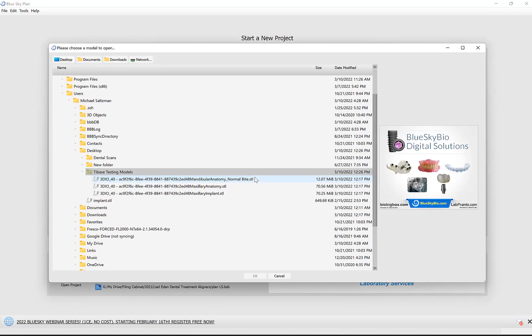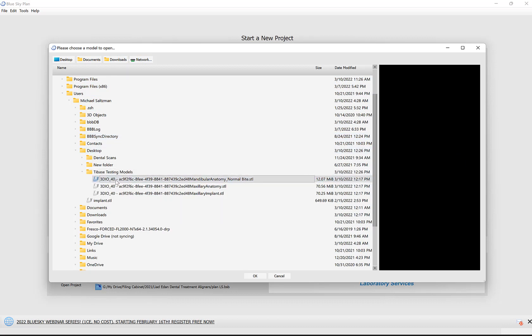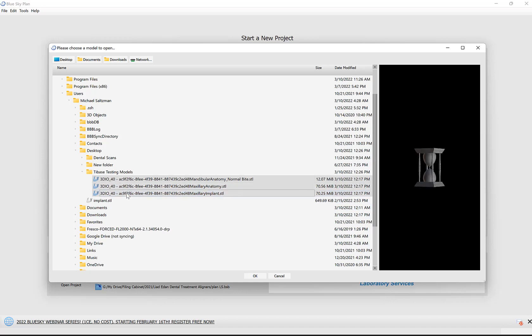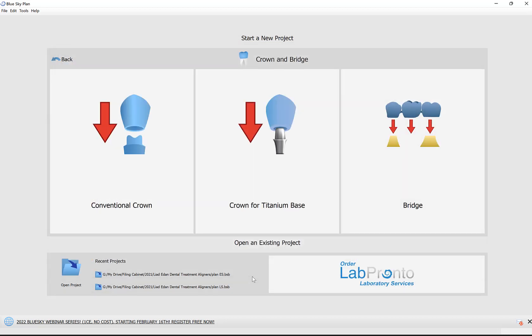The software prompts us to select the relevant data files. We have shortcuts: Desktop, Documents, Downloads, and Network on top. I'm going to left click on the first file, hold down the shift key, left click on the last file. All relevant files in between are selected as well, then click OK to load the files into the software.